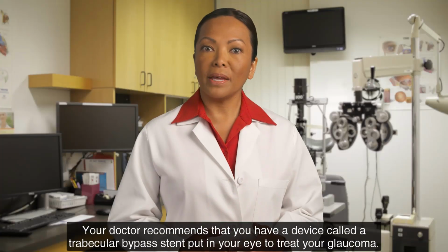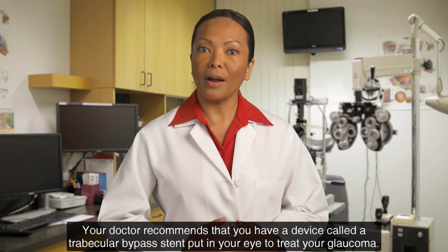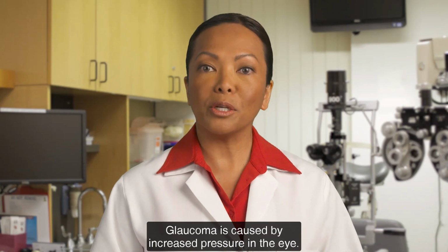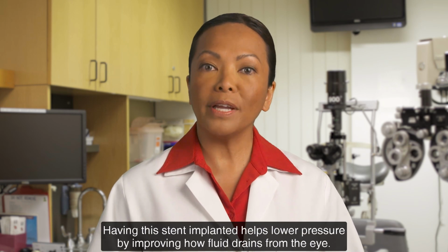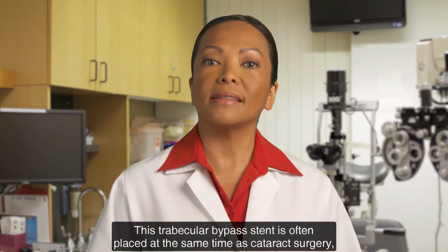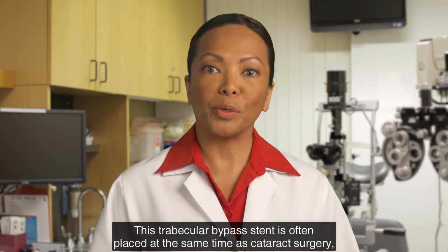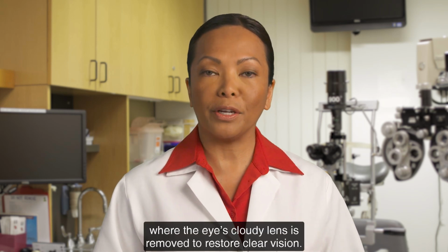Your doctor recommends that you have a device called a trabecular bypass stent put in your eye to treat your glaucoma. Glaucoma is caused by increased pressure in the eye. Having this stent implanted helps lower pressure by improving how fluid drains from the eye. This trabecular bypass stent is often placed at the same time as cataract surgery, where the eye's cloudy lens is removed to restore clear vision.